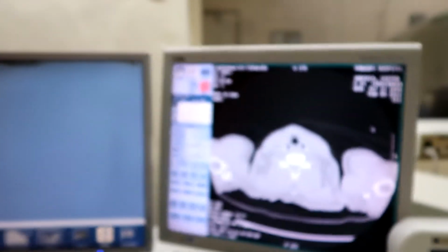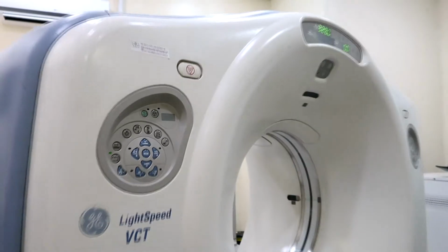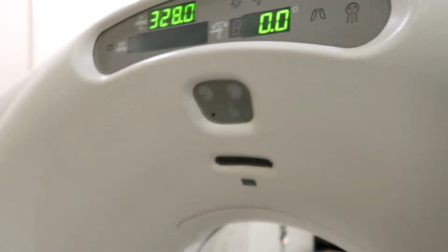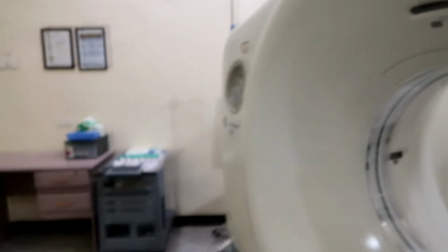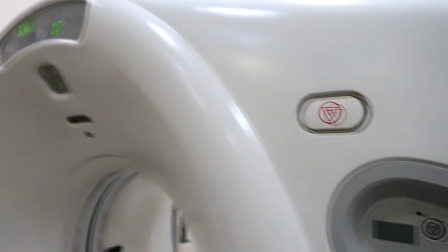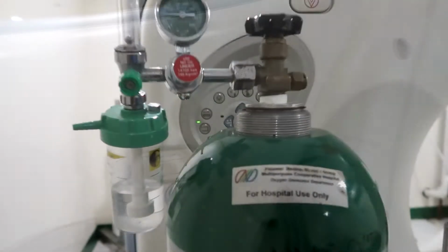Be sure the part of interest is free from any metallic objects which can produce artifacts to avoid re-exposure. Check last menstrual period, especially for childbearing patients, to avoid the risk of being exposed. The official results for normal studies are released after 24 hours, while special procedures are released after 48 hours depending on the severity of the case.